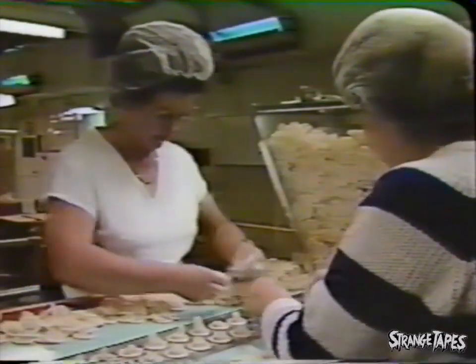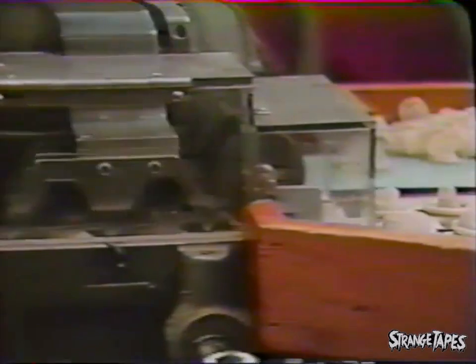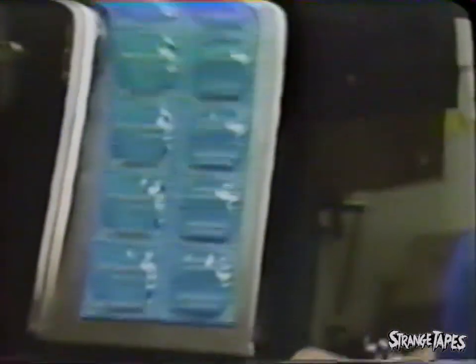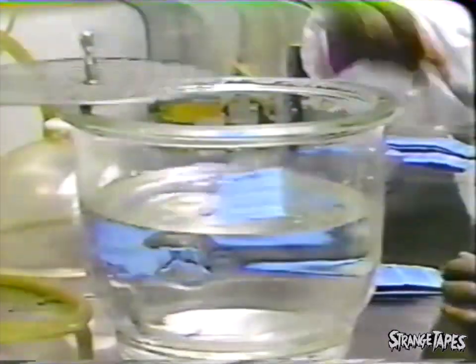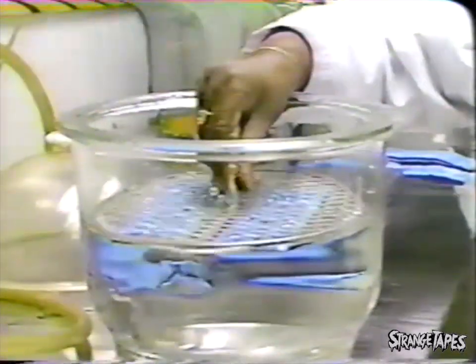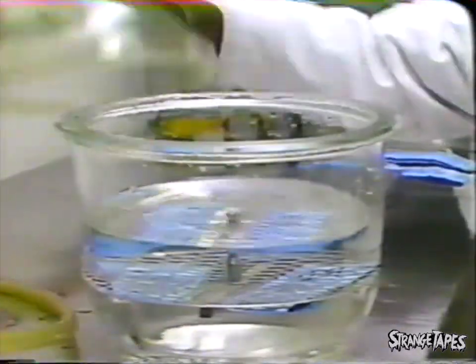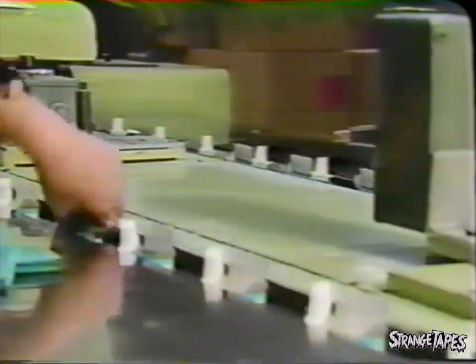Following these rigorous quality control tests, the condoms are prepared for lubrication and continue to the foiling stage. A final inspection checks a condom's physical properties and seal integrity. Then Trojan condoms are packaged and prepared for shipment nationwide.